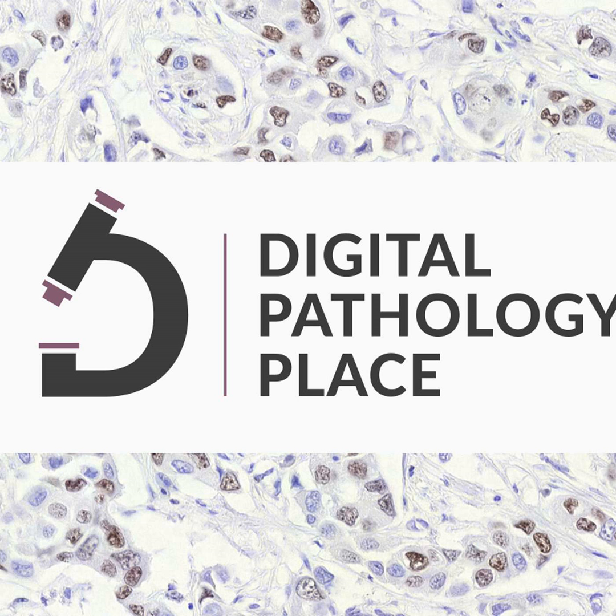It's just the tool? No, the whole lab. It's quality management systems, the competence of the personnel, how everything operates against established standards like ISO 15189:2022. And here's a really interesting point they make. Usually, the DP tool itself gets validated as an LDT within that already accredited workflow.